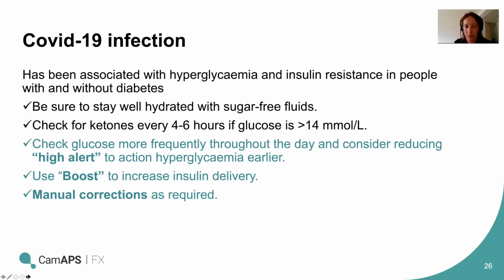Again, boost is really, really helpful just to increase that insulin delivery. And if needed, as Fiona mentioned, you can always use manual corrections just to get things back into range if boost is taking a little bit too long.